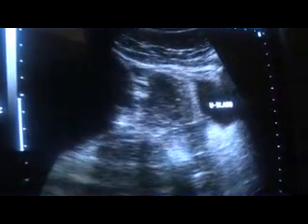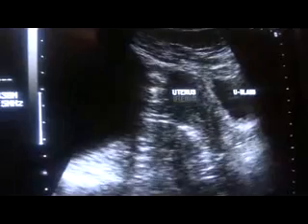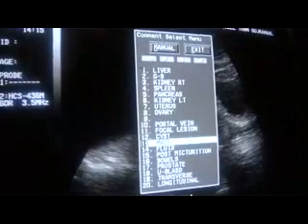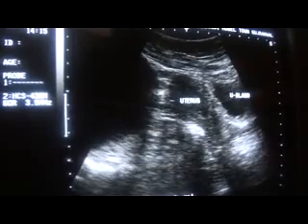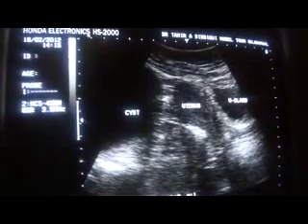This is an ultrasound of the female pelvis in the longitudinal section. This area is the urinary bladder, and this area is the uterus. This is the uterus in longitudinal section, and from here you see a cystic area from the right adnexa.